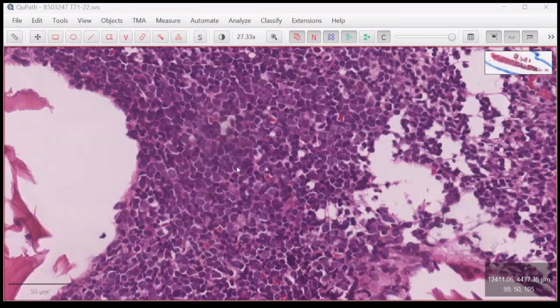And now maybe we can move to T2223, the one where the clinician agreed that the patient is in remission, and even our count also recovered with no blast. But based on the trephine, we can see that they are following a hematogone pattern, but the TdT is actually in small clusters. Okay. T2223.